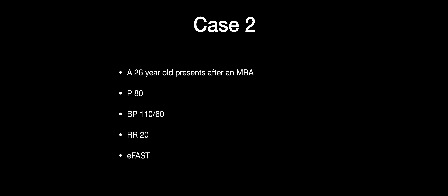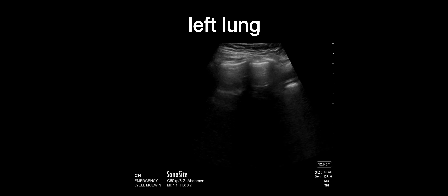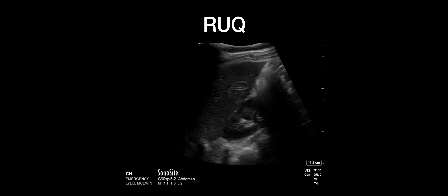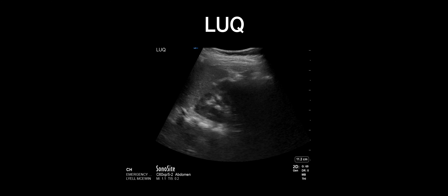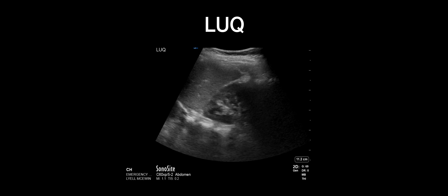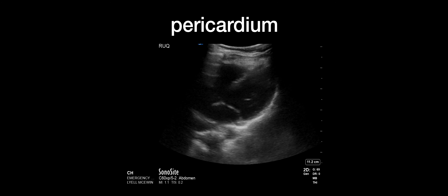Case two is a 26-year-old who presents after a motorcycle accident with almost normal vital signs. Looking at the left lung, some people get confused by a slight shadowing of the pericardium adjacent to lung sliding on the left side. The right upper quadrant unfortunately has inadvertent zoom applied. That is the left upper quadrant, and this is looking at the subcostal pericardium.